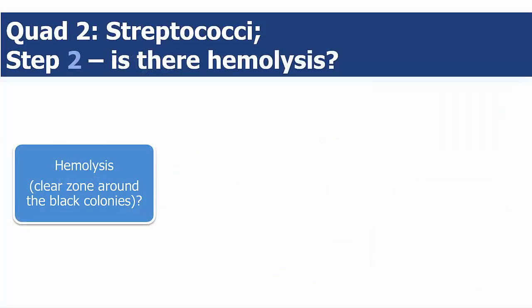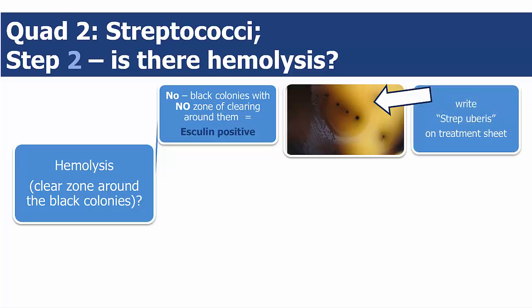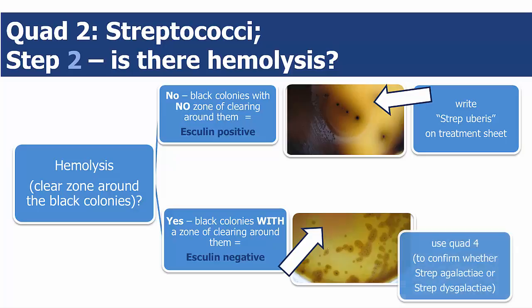You will notice that colonies in this quadrant may demonstrate what is known as hemolysis. Hemolysis is when the bacteria breaks down the agar around the bacteria colony and causes what looks like a clear ring or zone around it. If you see black colonies with no zone of clearing or no hemolysis, that indicates esculin-positive strep uberis. Black colonies with hemolysis, a zone of clearing around them, indicate esculin-negative strep agalactia or strep dysgalactia.